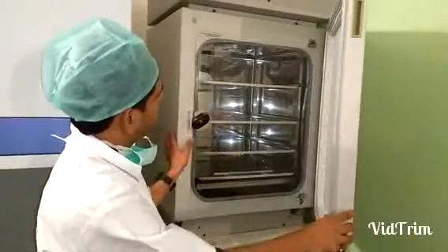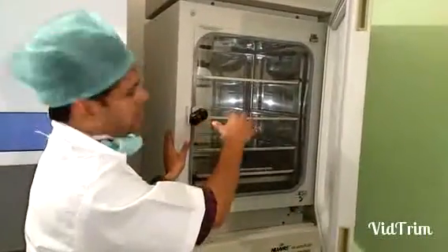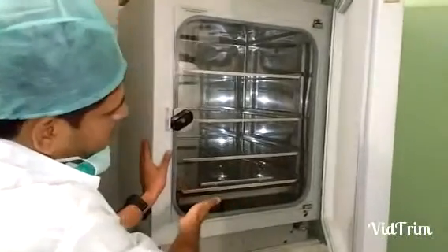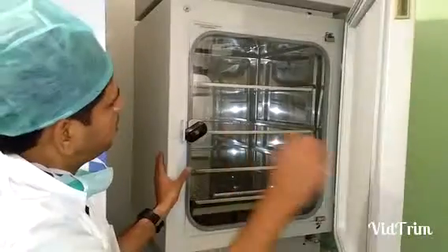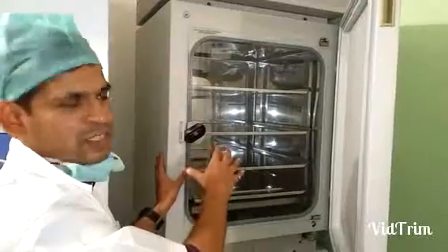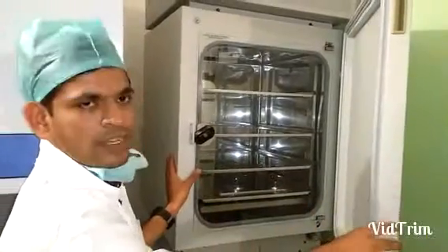As you can see, we keep the dishes in which the embryos are cultured on this shelf. There are four shelves and a water tray at the bottom. The inner chamber is made of corrosion-free stainless steel.